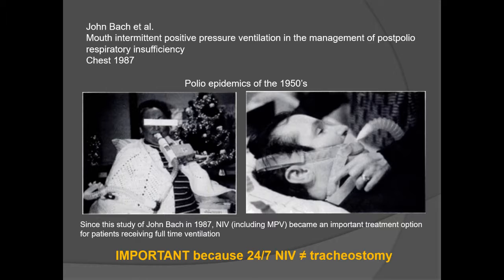So it was, for the world, a big challenge and new information that it's possible to manage patients with non-invasive ventilation 24 hours, 7 days.